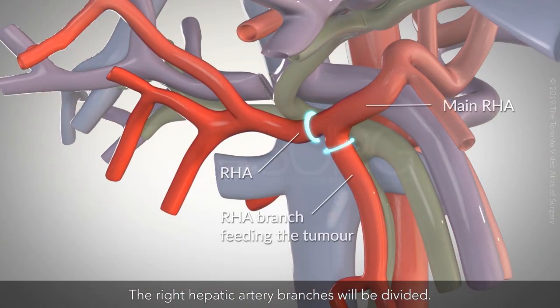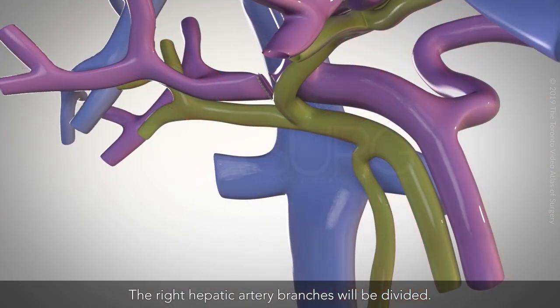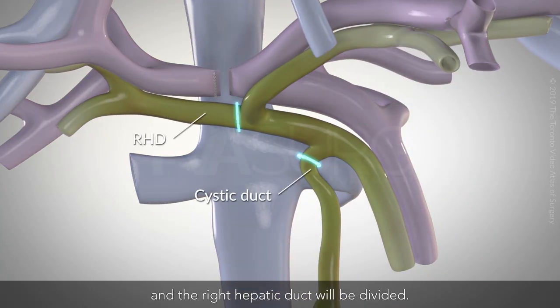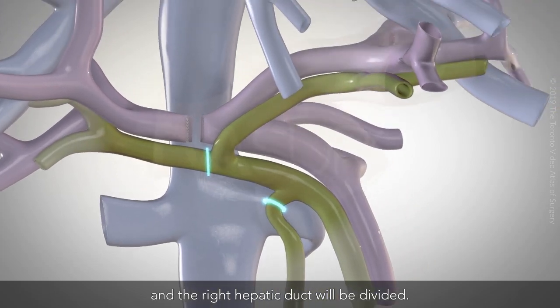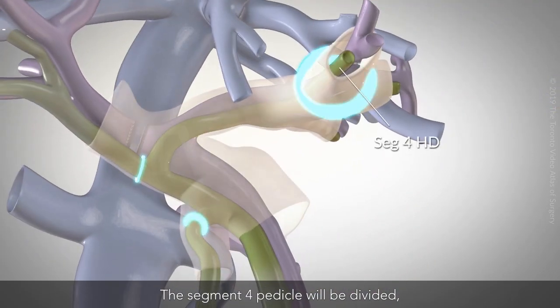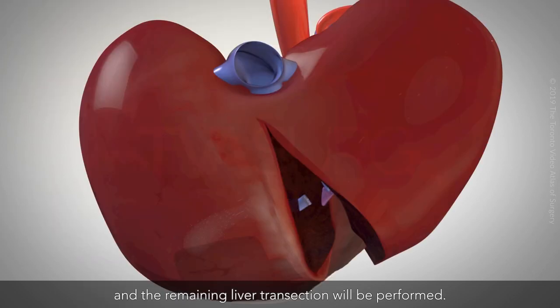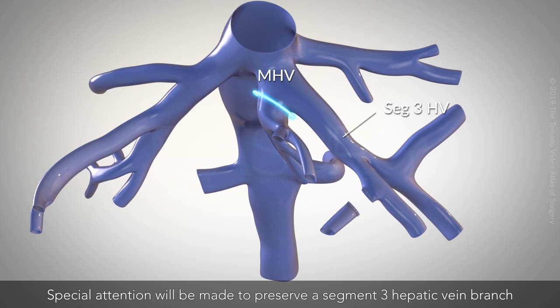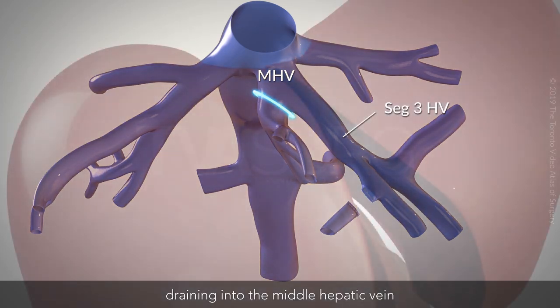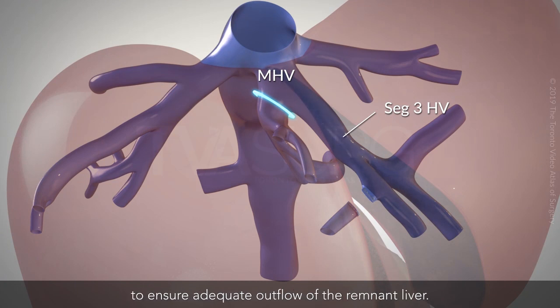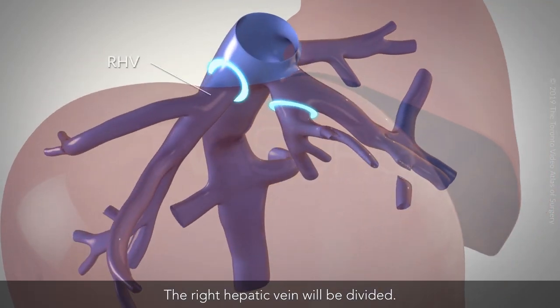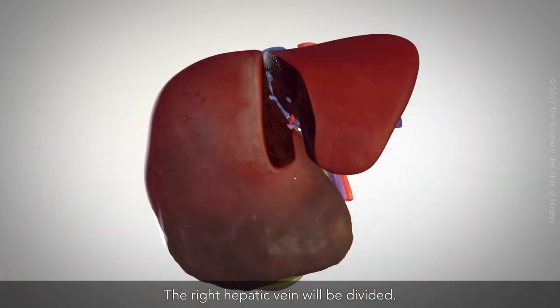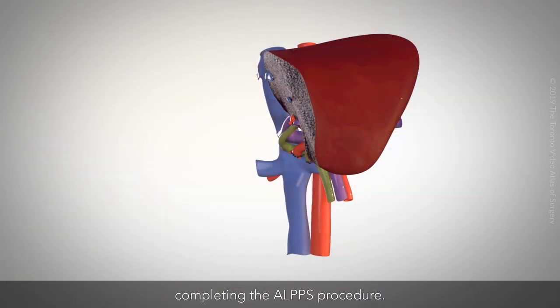The right hepatic artery branches will be divided. The cystic duct and the right hepatic duct will be divided. The Segment 4 pedicle will be divided, and the remaining liver transection will be performed. The middle hepatic vein will be divided, with special attention made to preserve a Segment 3 hepatic vein branch draining into the middle hepatic vein to ensure adequate outflow of the remnant liver. The right hepatic vein will be divided and the specimen will be removed, completing the ALPPS procedure.